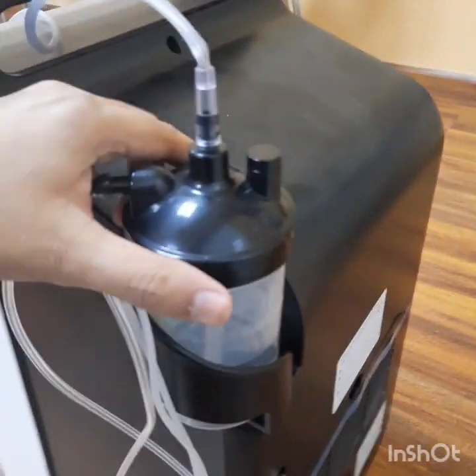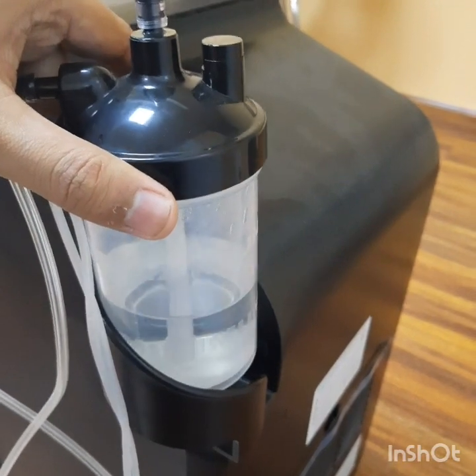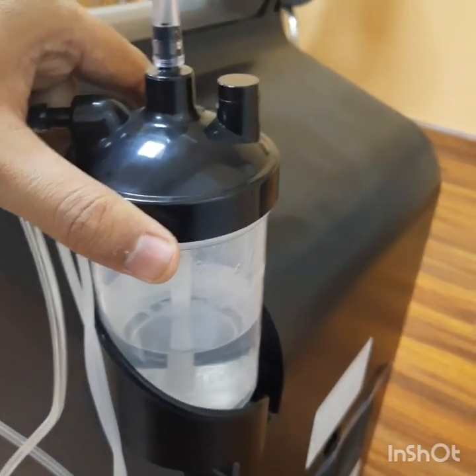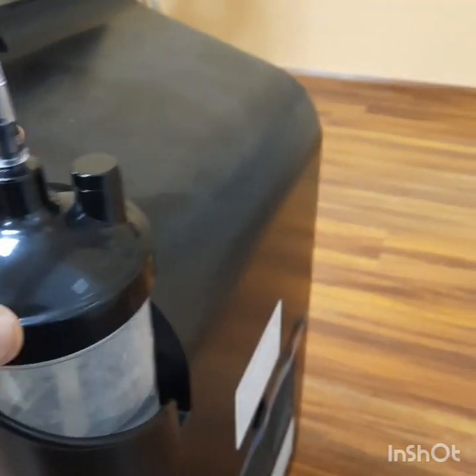This is the Humidification Bottle. We need to fill the water between the maximum and minimum level marks, and change the water on a daily basis.